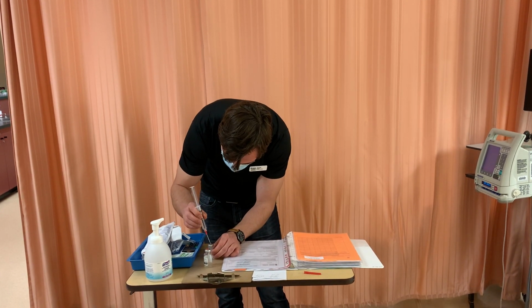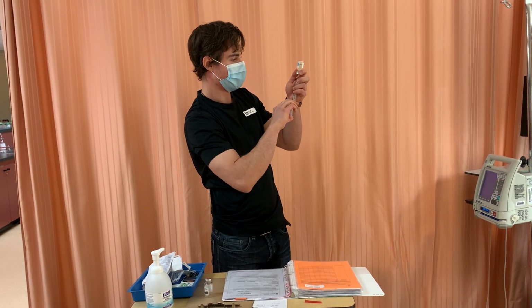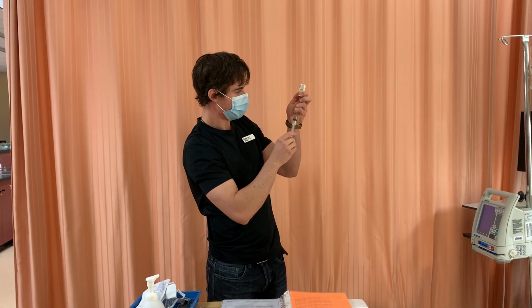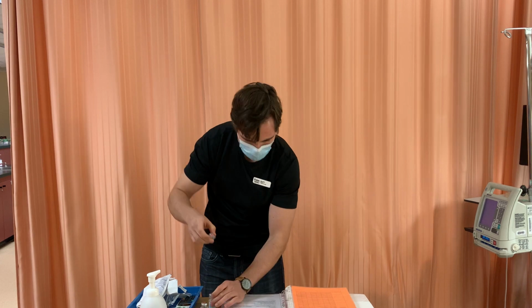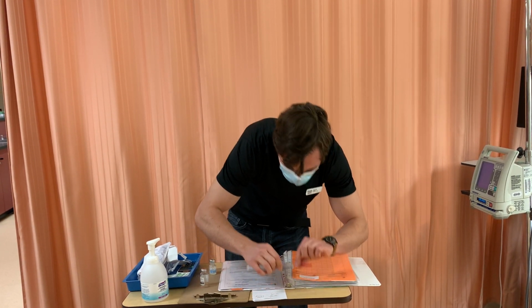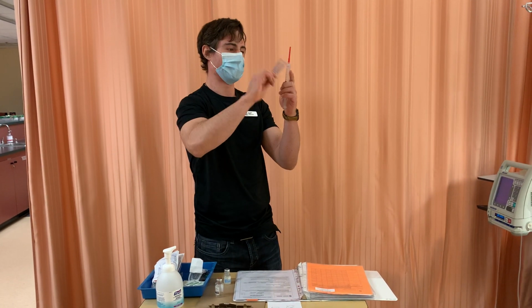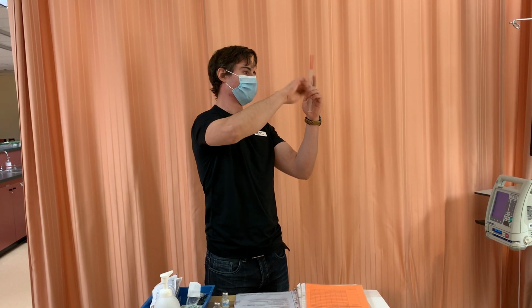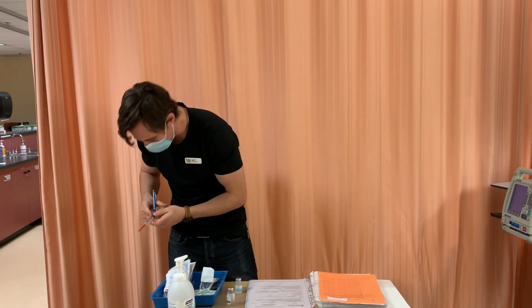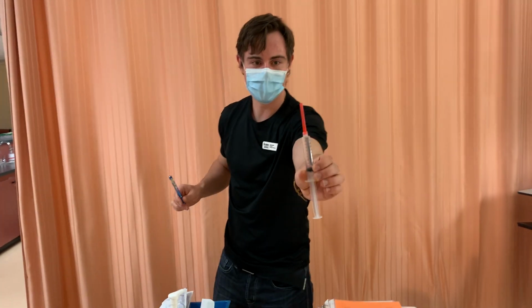So I'm going to inject, pull out a little bit extra, do the scoop method. I'm going to clean this one again because it's been standing there for a while. Make sure there's no bubbles in there. I'm going to go over the sink and get out the excess. So I do have 10 there.